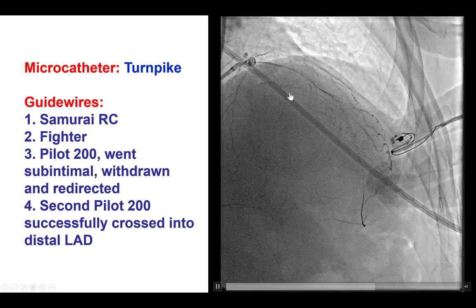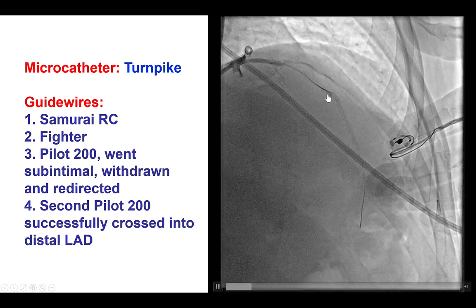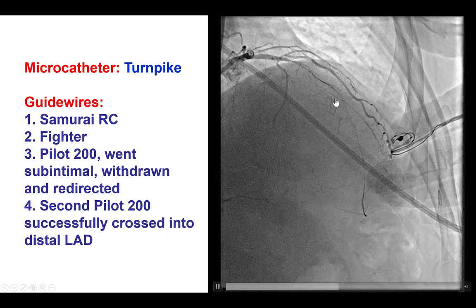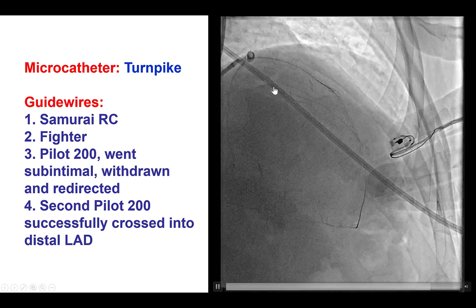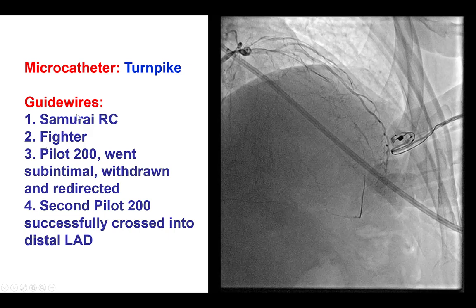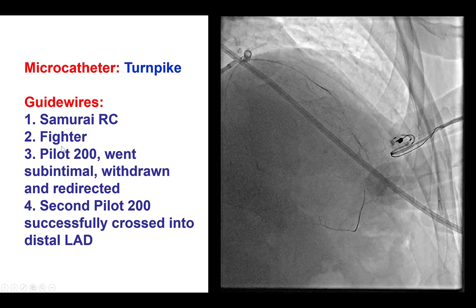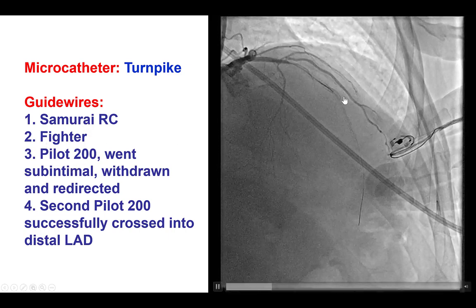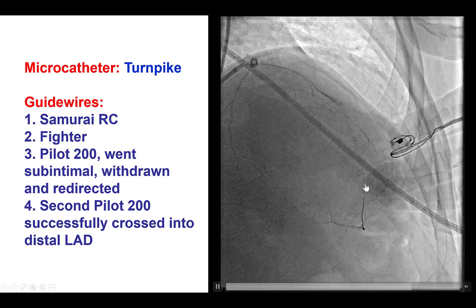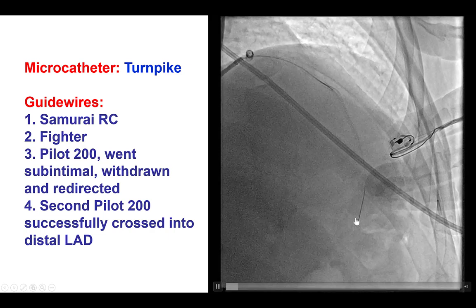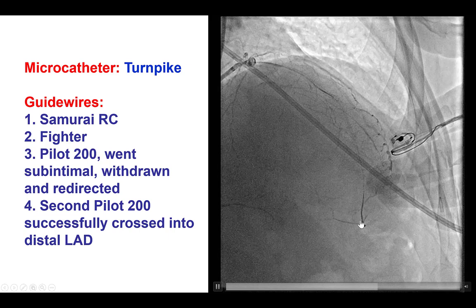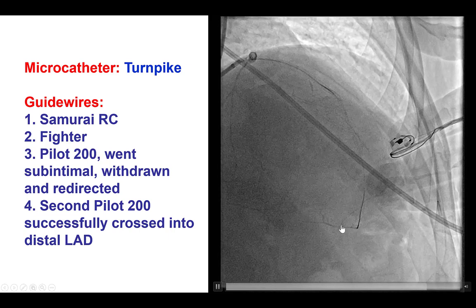A Turnpike microcatheter was advanced to the proximal cap, and then multiple wires were used. There was no success with a Samurai or a CTO Fighter. However, a Pilot 200 initially went under the stent, but then was redirected and eventually crossed into the distal true lumen, as confirmed by ipsilateral injection.